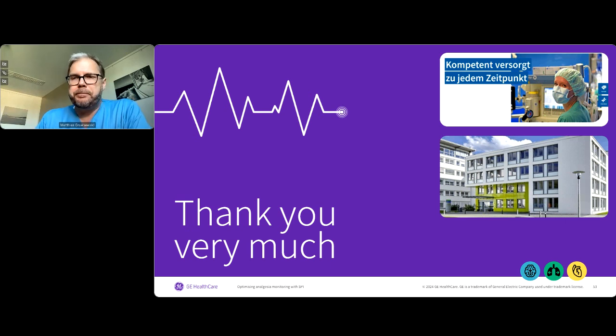But using SPI is like a boost of the signal. So you will miss seeing those boosts by just looking at blood pressure intermittently, let's say every 3 minutes. Heart rate, I've shown you, is not a good variable because it's much slower and the amplitude is much lower.